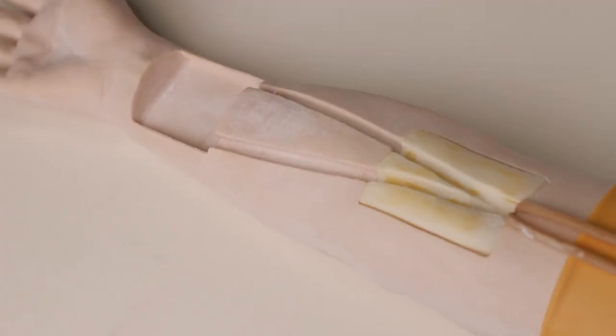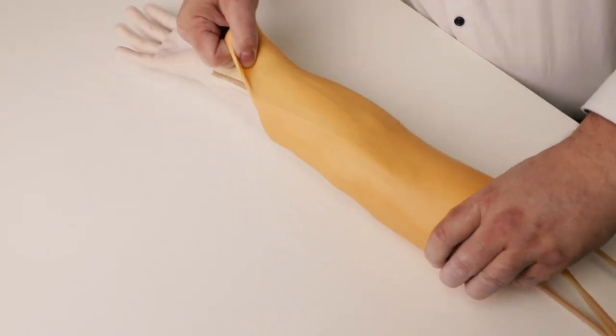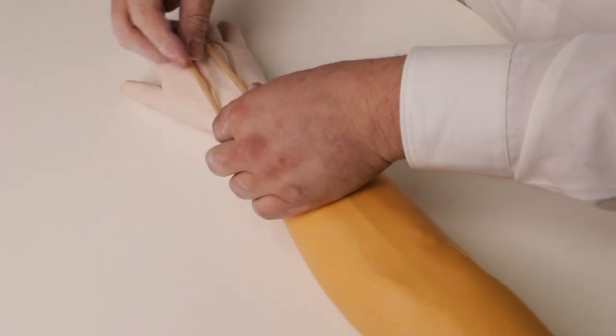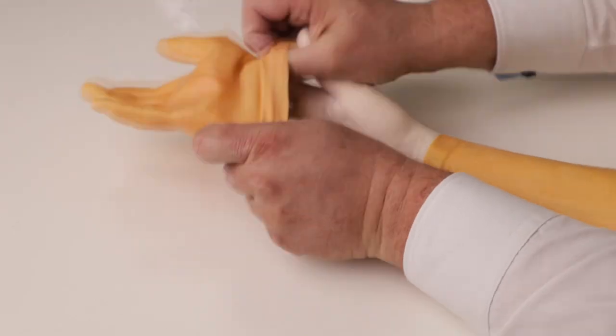Insert the puncture pads and place the tubes into the groove. Pull the skin forward until it is completely in place. Make sure to keep the veins in the grooves. Pull the hand skin over the hand. Do not forget the powder.